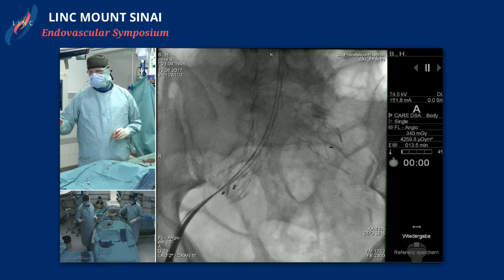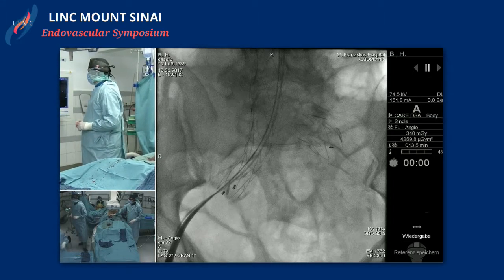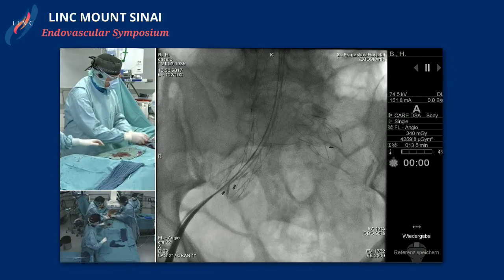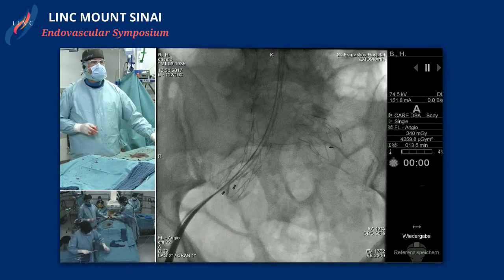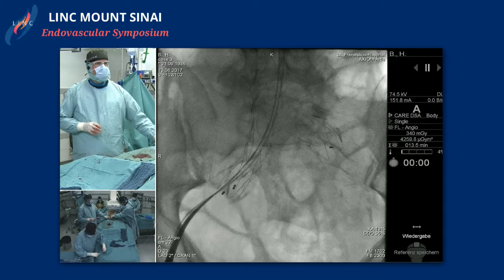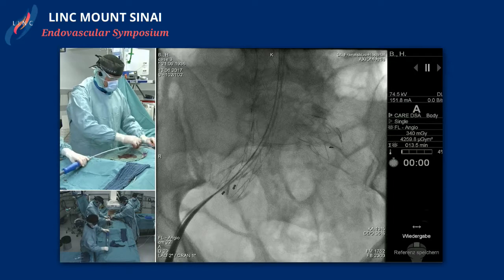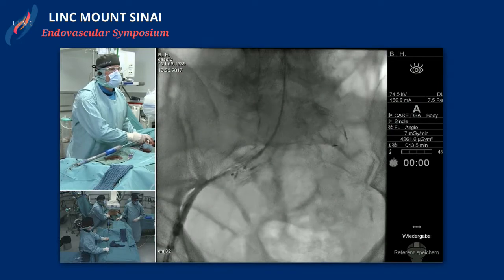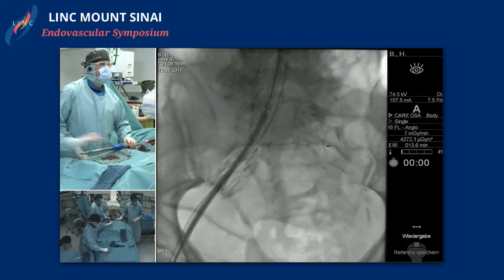The next step would be, we've taken a tube from Endurant. It's a diameter of 36, prepared. Okay, push well. And it's 70 millimeters long. 17 millimeters. And if this is not enough, we can use another one to extend it in the existing Talent endograft. 70. So hopefully we come, yes, it goes through. You can see it. A little hooking, but not very severe.